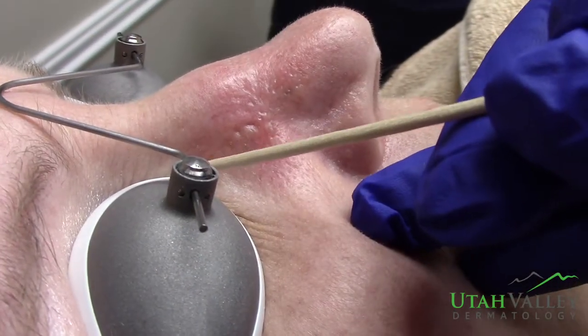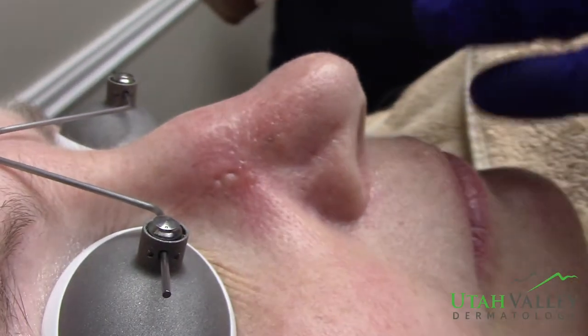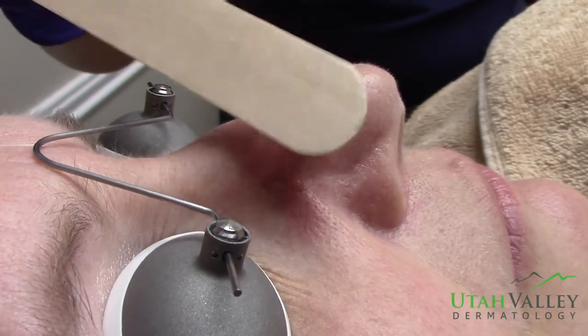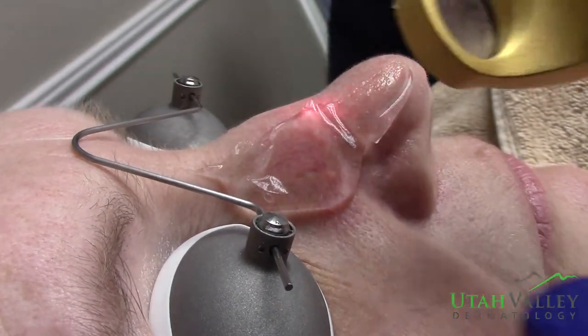You can see here is her skin cancer scar, but here's really where she's had increased blood vessel growth and has none of that on the other side. So we're going to treat that right now with the laser. We're going to put on some gel and here we go.